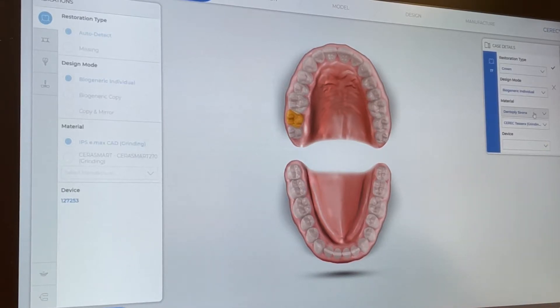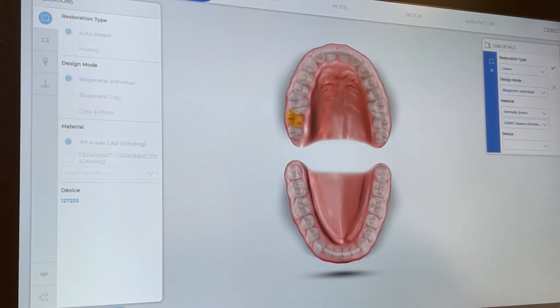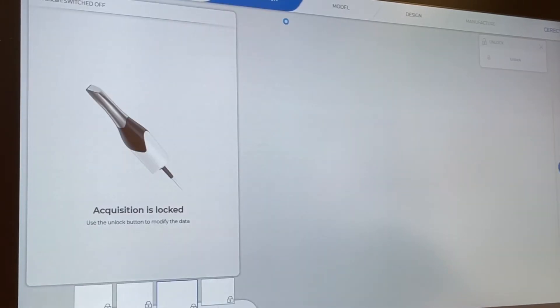First we're going to start with the acquisition. We are picking out our crown type — Dentsply Sirona — and it will be a Tessera crown. Save that, and now let's get into our scanning. Scan the upper, scan the lower, scan the bite.